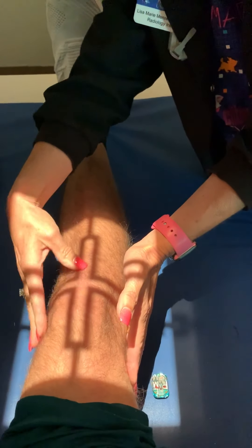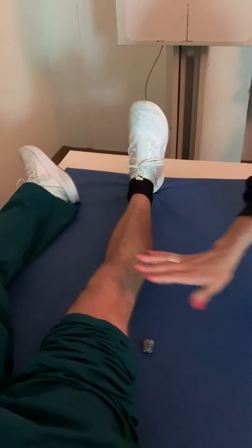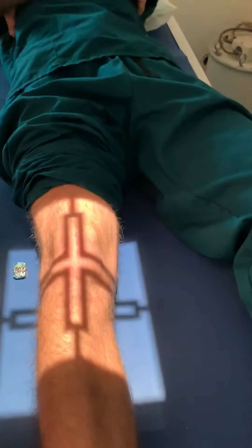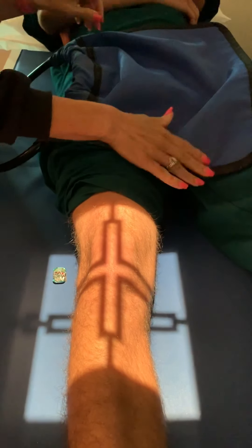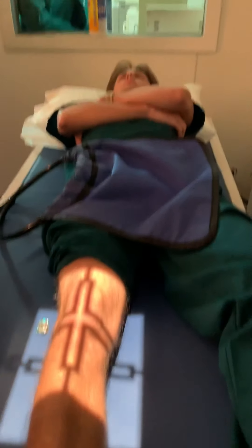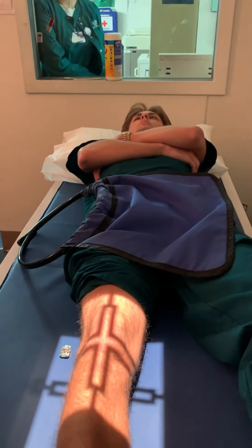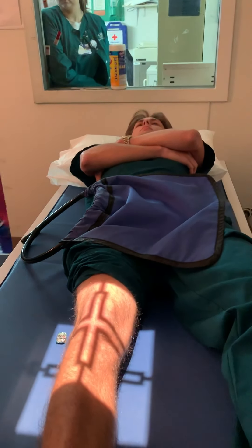This is his right knee, and I'm going to put the marker lateral to the part. I could collimate side to side, but I'm comfortable leaving it. Again, apex — half an inch distal to the apex in midline, coming right down the middle of his leg and the middle of his knee. I'm going to shield him. Hold still right there — I'm set at 80 at 3.8. Good, you can relax.